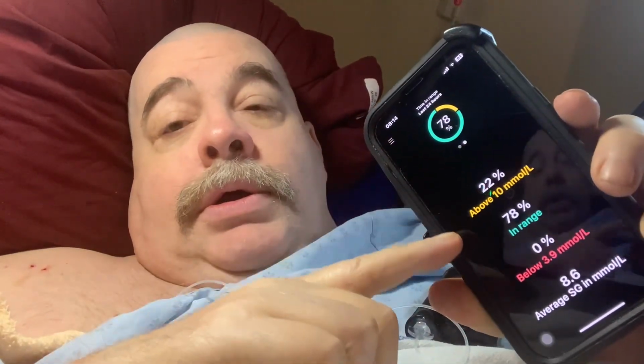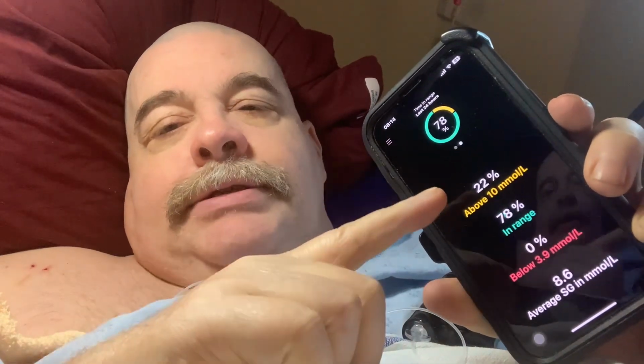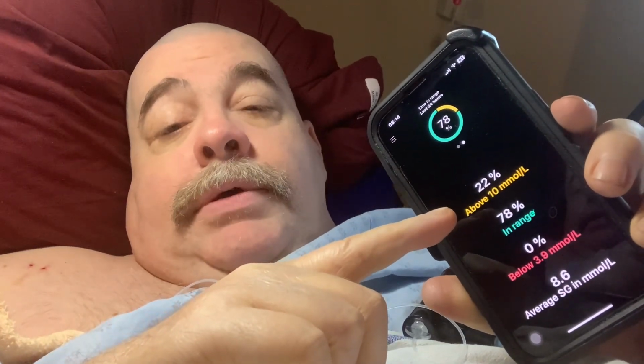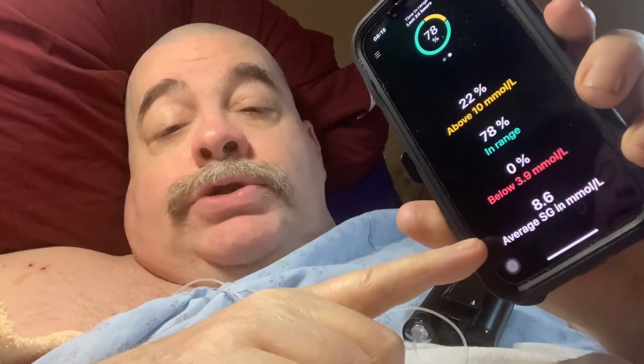Now the pump, if you have the sensor with the pump and auto mode, it will do your blood sugars every 5 minutes. Which means, I think it's 288 times a day. And because of this, you could get into your time in range. And this is where I get these numbers that I've talked about a number of times at the beginning. You get your above, your below, and then your average sugar.